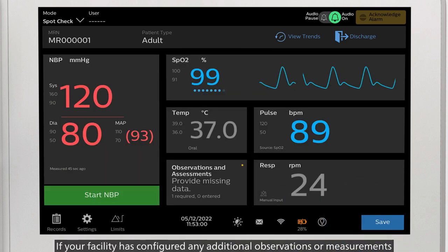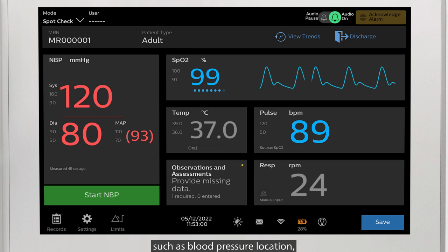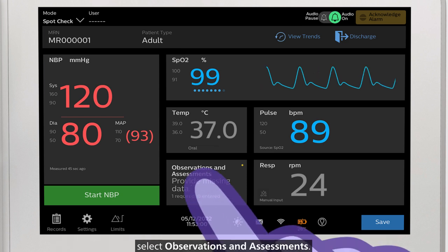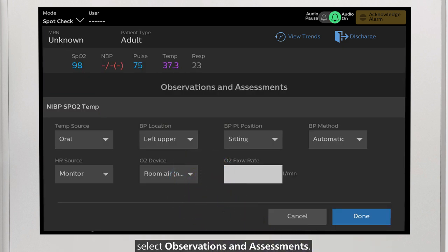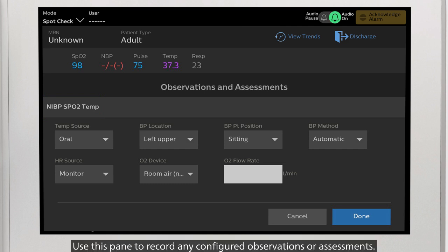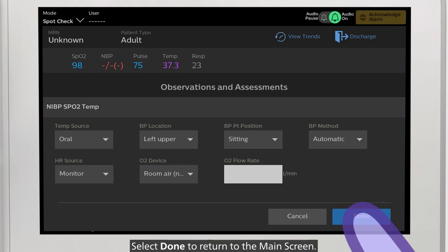If your facility has configured any additional observations or measurements, such as blood pressure location, select Observations and Assessments. Use this pane to record any configured observations or assessments, then select Done to return to the main screen.